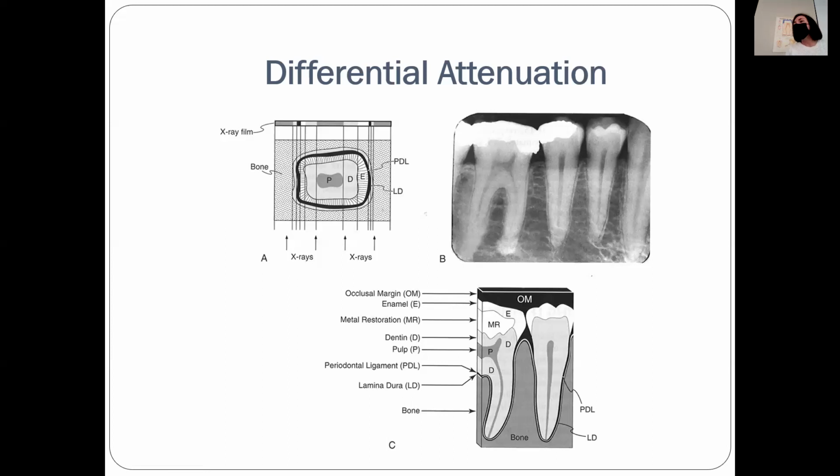So the main way that I can tell composites is that I look for the prep marks. When you're looking at a natural tooth, you'll see a shape that mimics the shape of the crown, but more swoopy. But if it's a composite, oftentimes it will have a prepped box cut out of it. So a lot of times that's what you can see.